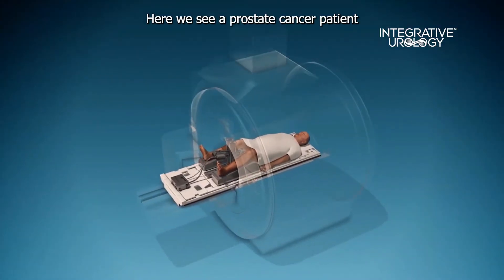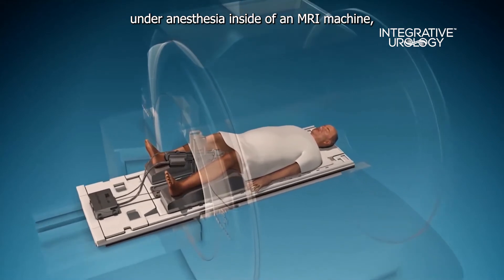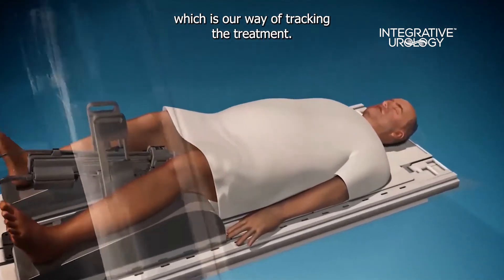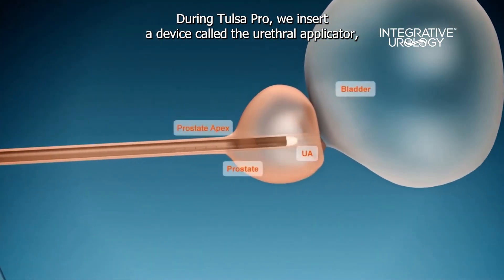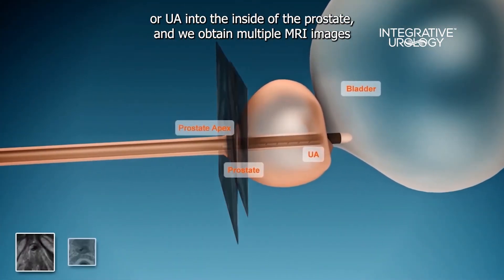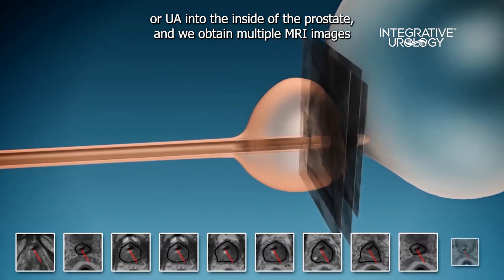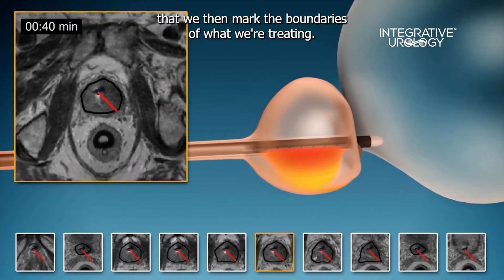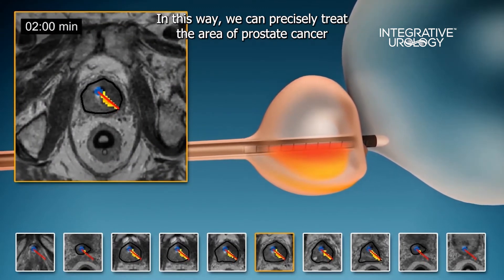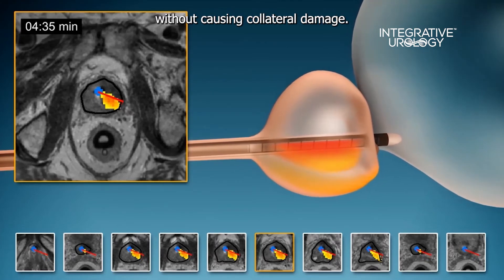Here we see a prostate cancer patient under anesthesia inside of an MRI machine, which is our way of tracking the treatment. During Tulsa Pro, we insert a device called the urethral applicator, or UA, into the inside of the prostate, and we obtain multiple MRI images that we then use to mark the boundaries of what we're treating. In this way, we can precisely treat the area of prostate cancer without causing collateral damage.